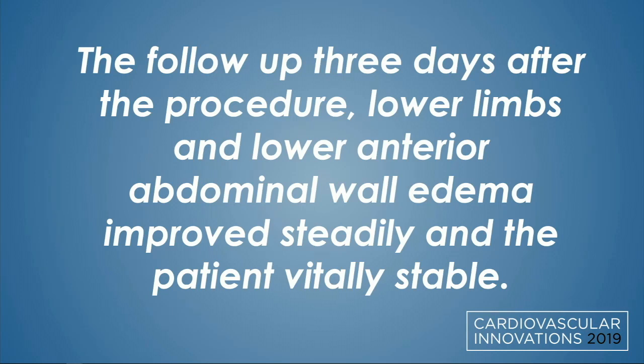Just to make a comment, you have a good point, because when we're doing SVCs, IVCs, and iliacs, post-constriction the vein is dilated because the pressures are higher. So if you do IVUS and size it, you can get an appropriate size. If the stent is going to start from above, and the vein happens to be bigger from above, and it's under-expanded because there's not enough flow, then you want to oversize as much as possible. That's why sometimes we put 20, 22 in the IVC or SVC.